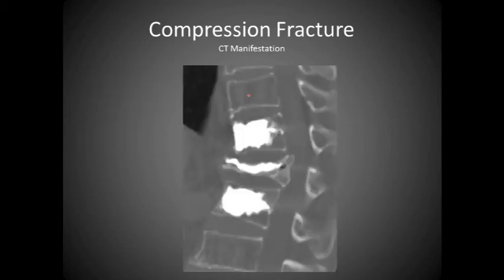So here we have a patient who has had kyphoplasty, which is the cement structure that is seen here. As we can tell, the patient does have osteoporosis simply due to the fact that none of the margins of the vertebral body do have any density left whatsoever, and simply because we have 3 levels that have kyphoplasty.